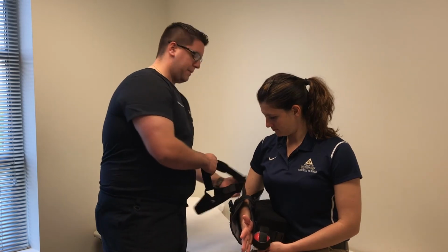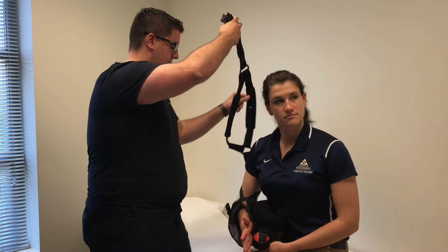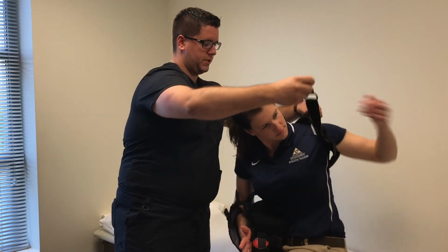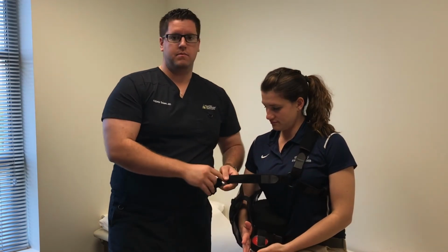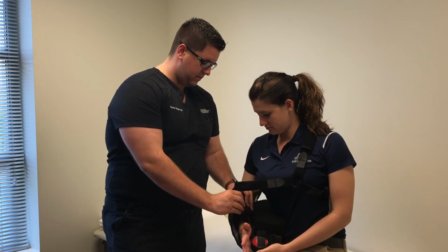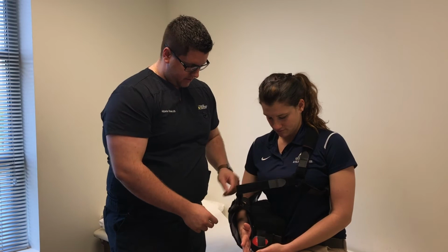The next step is just like putting on a backpack or a shirt. Help the patient by bringing it over to the side, just like this. Put their arm into it, just like a backpack, and bring it in the front. And after this, you're almost done. Just clip the clips back in, and you're all set.